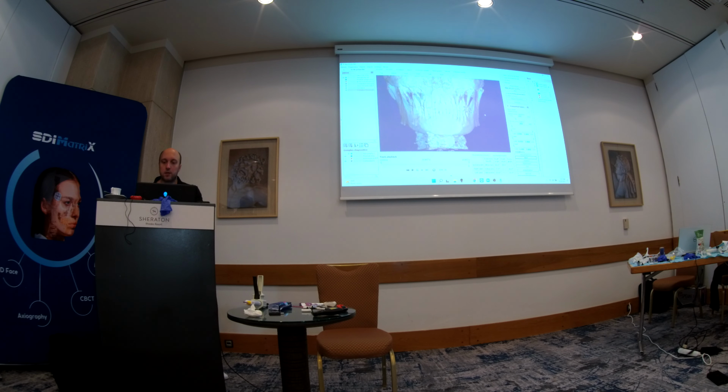You can also do that by cutting in the Y range, rotating the CBCT, and putting the point from the inside on the incisal edge.